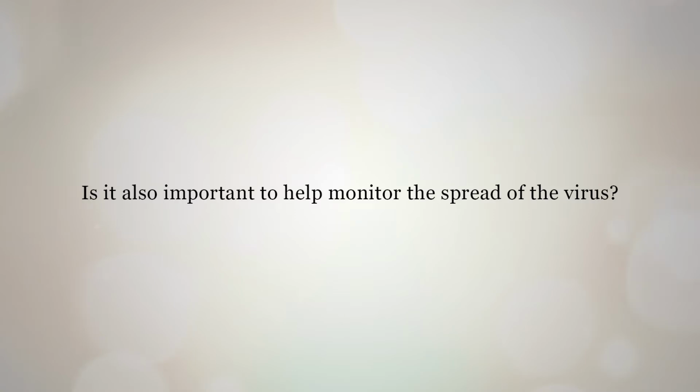Well, when you're trying to monitor the emergence of a particular disease, you have to be able to definitively say this person was infected with this particular pathogen. So you need a specific test that can definitively say this person was infected with the virus or not. Absolutely, and it's particularly important in this because of the range of symptoms from asymptomatic to fairly severe illness with symptoms that is common for this time of year, in particular with influenza-like illness and the common cold.